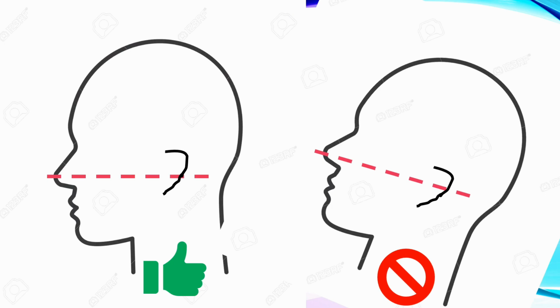There are different techniques when taking radiographic images. Most dental assisting radiographers utilize the paralleling technique. It's the best technique or the preferred technique because it eliminates distortion, so it represents an accurate representation of the anatomy of the tooth. Whenever possible, what the paralleling technique relies on is to first make sure that the ala-tragus line is parallel to the floor. You can see this in the image on the left.